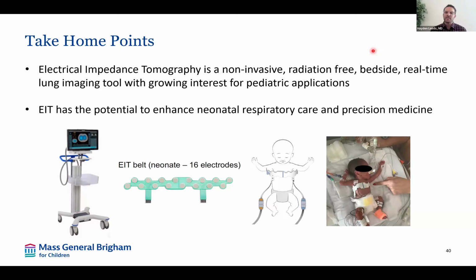Perfect. I think this actually gets to the next question. To use the actual PEEP titration tool on the device, it really only works if the patient is muscle relaxed or not spontaneously breathing, as it needs stable breath cycles to calculate the compliance at each pixel and get that nice compliance, overdistension and collapse curve where it looks at the crossing point. Obviously, you could do this offline and do your own analysis with a spontaneously breathing patient. But for the actual tool to work, it often works best if they're completely paralyzed or not spontaneously breathing.